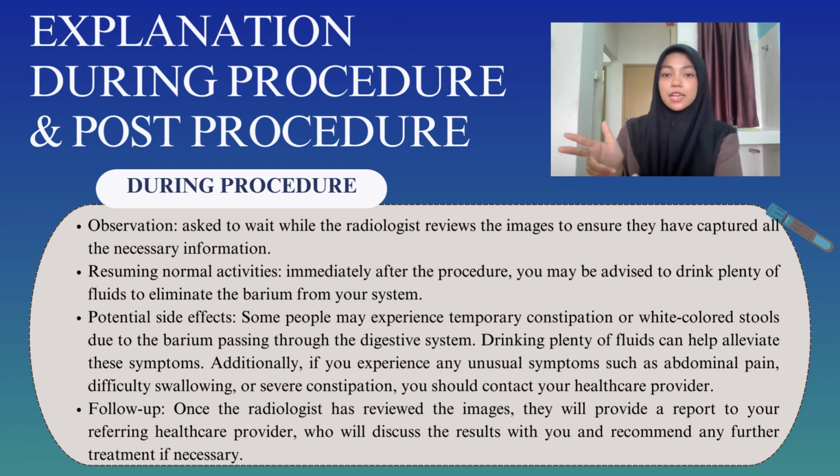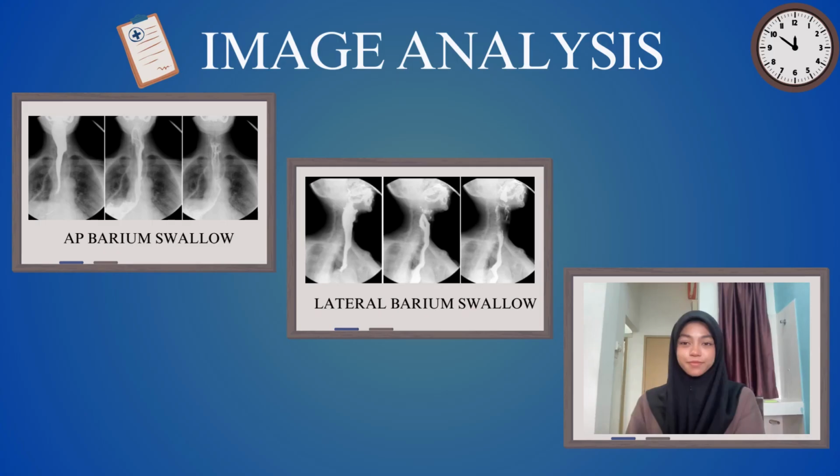Additionally, if you experience any unusual symptoms such as abdominal pain, difficulty swallowing, or severe constipation, you should contact your healthcare provider immediately. Last but not least is the follow-up. Once the radiologist has reviewed the images, they will provide a report to your referring healthcare provider, who will discuss the result with you and recommend any further treatment if necessary. Okay, we have gone through all the procedure. Now I will show our image analysis.